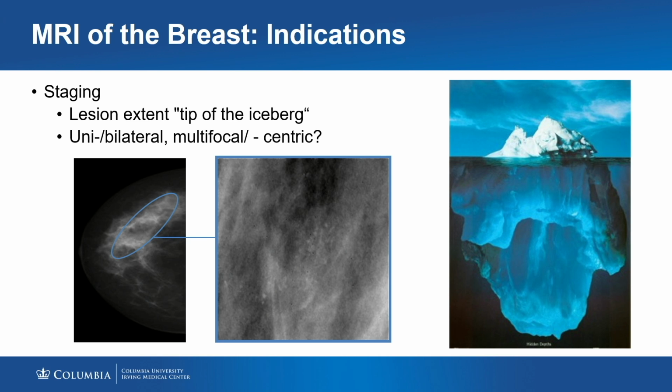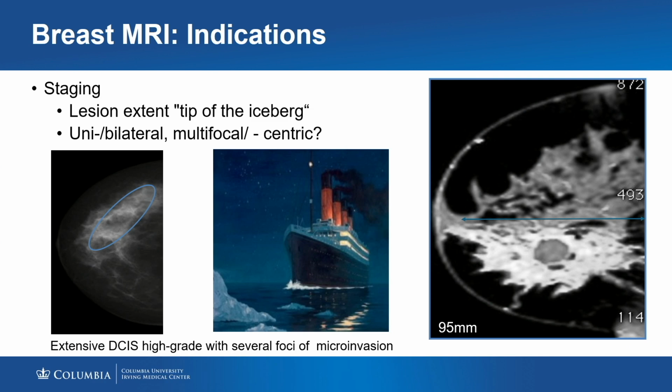And that was before the time when MRI was established for staging, and in particular that was the time when the mantra was we have calcifications, MRI is not good for that, we don't do that. So in that case, she participated in the study, and we saw after her biopsy, because you can of course do an MRI after biopsy, a segmental heterogeneous non-mass enhancement way exceeding the microcalcifications, which actually makes sense because that was a high-grade DCIS on biopsy.